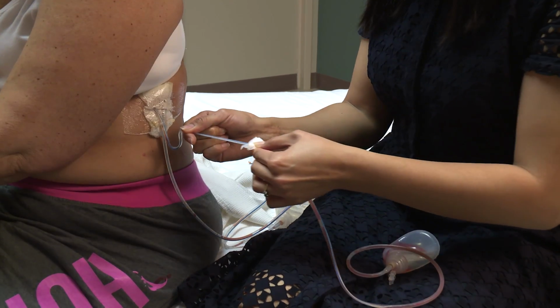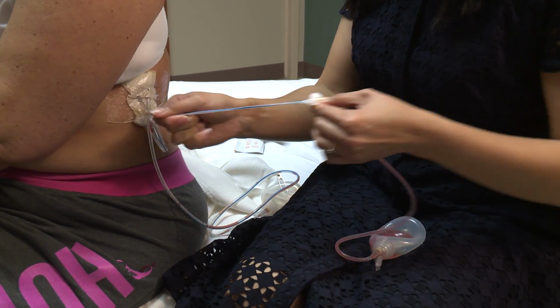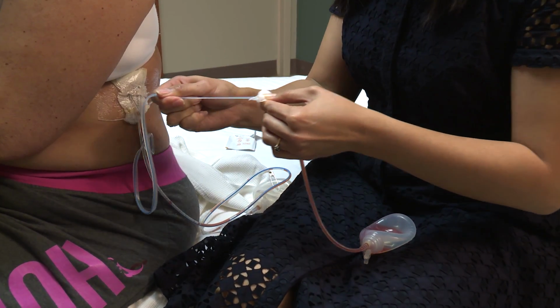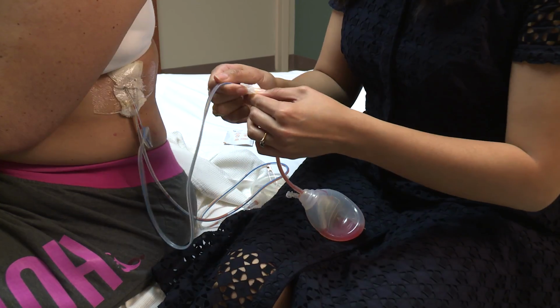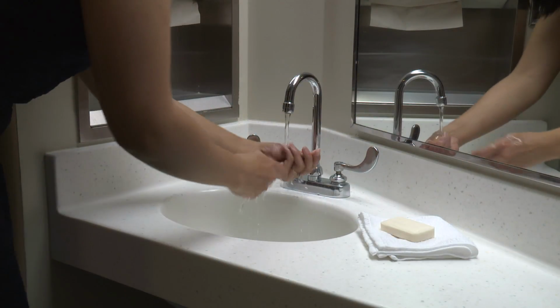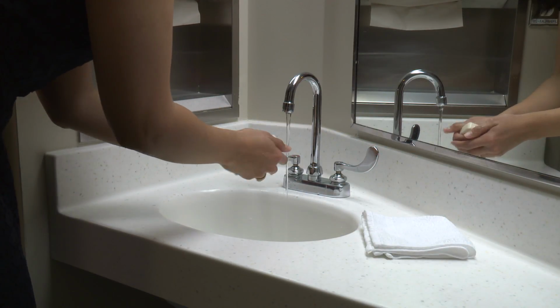Because you have a drain, you need to empty and measure the contents of the bulb. This is called stripping the drain. You must strip the drain at least 2 times a day to prevent the drain from becoming clogged with blood clots or fibrous material. To strip the drain, first wash your hands.